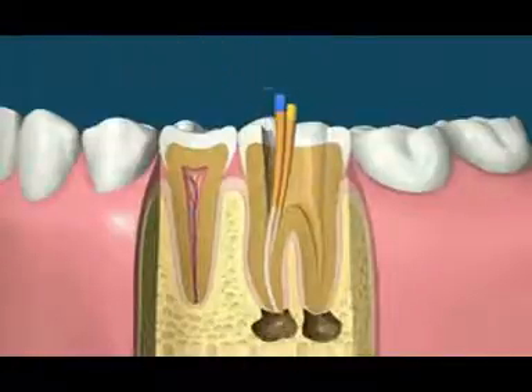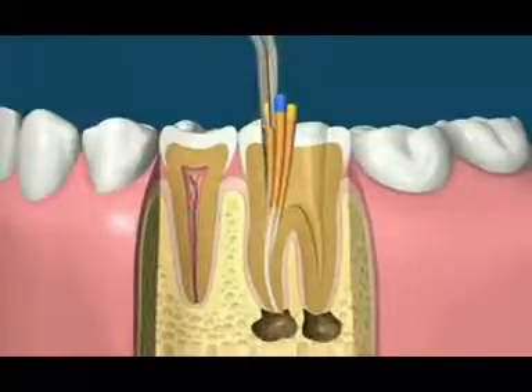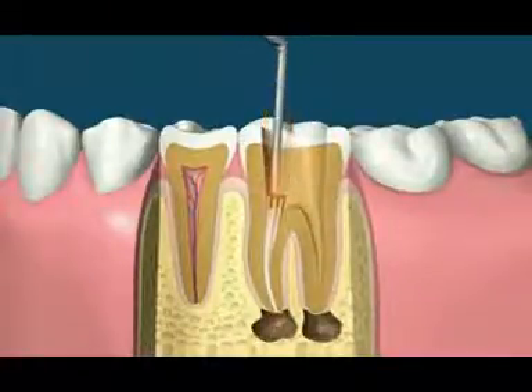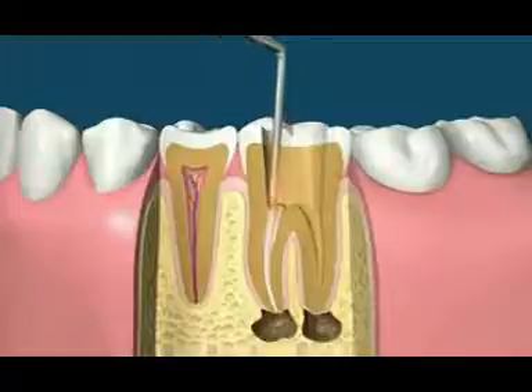After the canal is tightly sealed, the excess rubber cones can be removed with a heated instrument. The heated instrument can also be used to heat and compact the cones to better fill the canal space.